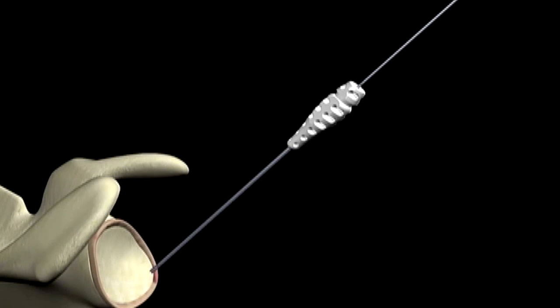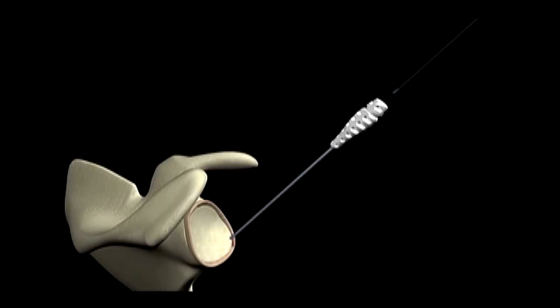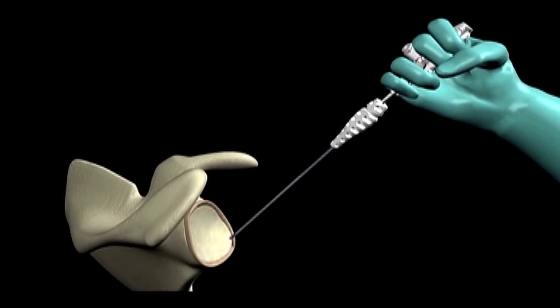While maintaining the guide position firmly against the bone, insert the juggernaut suture anchor through the guide and into the pilot hole.